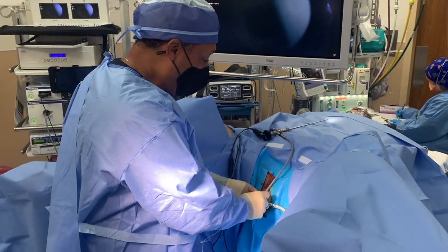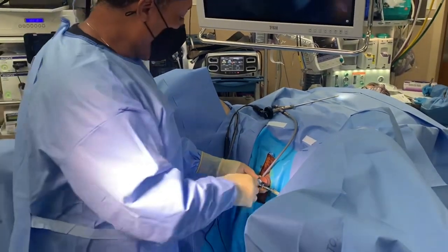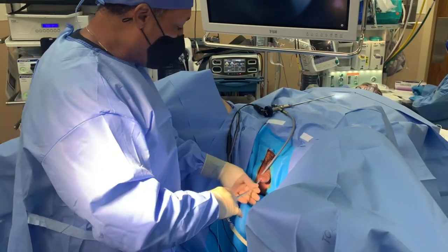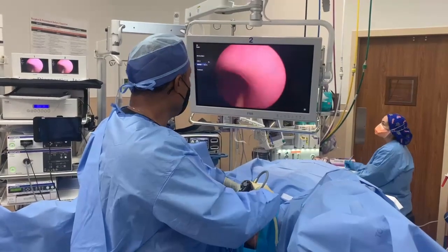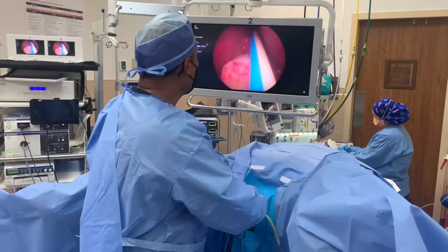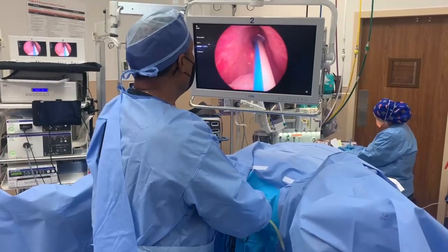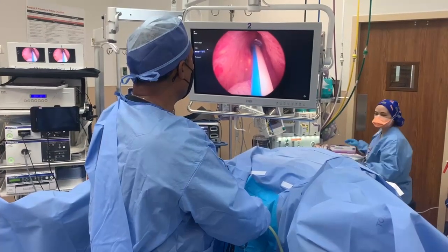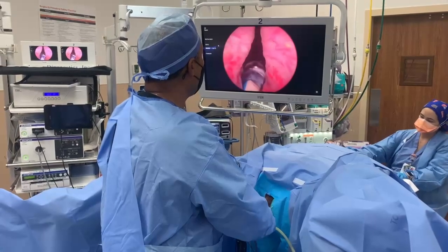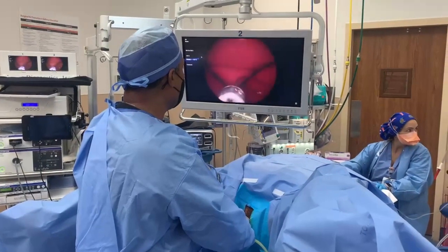So I know it's in the bladder now. We're going to remove the insertion sheath and then come alongside of it with the cystoscope. We're going in alongside the retrieval. We're into the prostate and you can see this gentleman has not such significant lateral lobes but he does have a high bladder neck. So I'm going in at greater than 60 degree angle to get into his bladder, and so this will be ideal for the I-10 device.